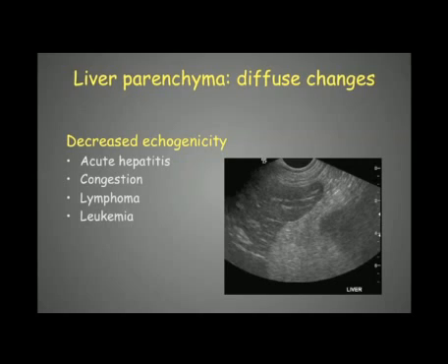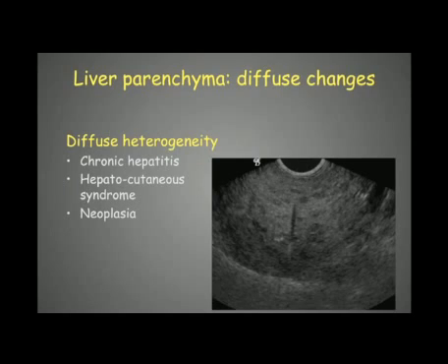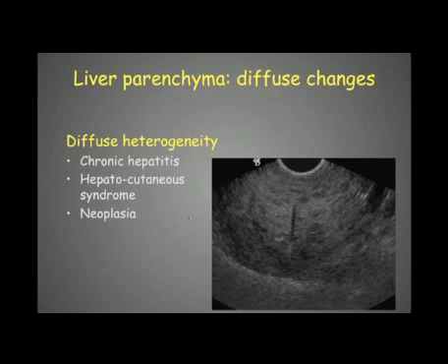As a final diffuse change, we can have diffuse heterogeneity of the liver, which is less common. It can be seen with chronic hepatitis, hepatocutaneous syndrome, and some cases of neoplasia — presenting as multiple hypoechoic areas dispersed throughout the parenchyma. In one example shown, aspiration revealed vacuolar degeneration.